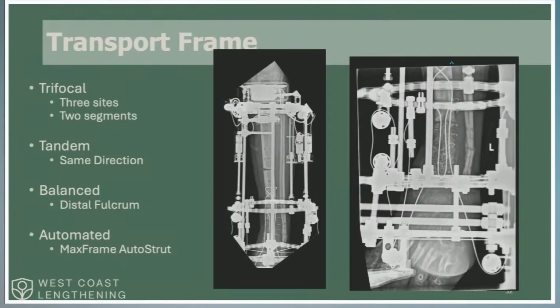to transport. So like I showed you before, this is a trifocal. We'd set this up as a trifocal. Advantage of that, you can close that gap twice as fast. And so here is a very traditional technique as described by Quinnen. This segment here is going to move at 1 times down. It goes down and out the skin here.